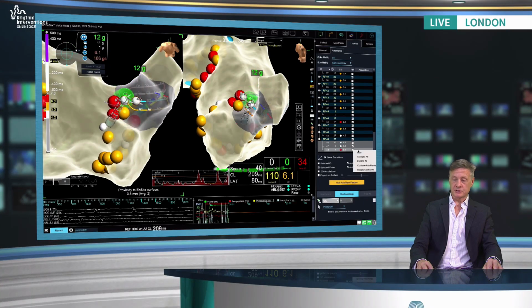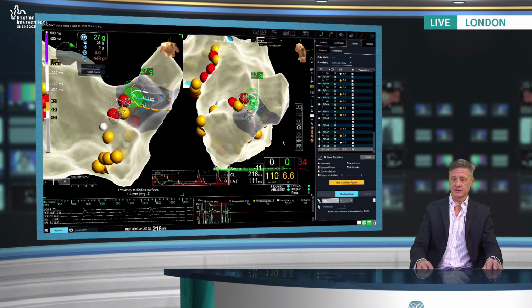Okay, well, that's a great question. So let me ask the panel, is this iatrogenic, or is this a phenomenon of debulking with the pulmonary veins? Maybe you can start with that one.